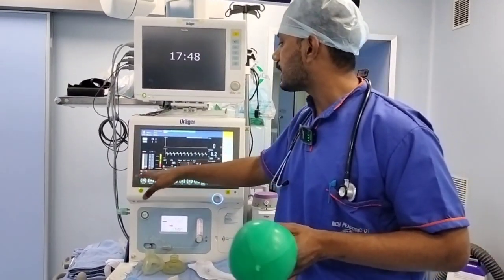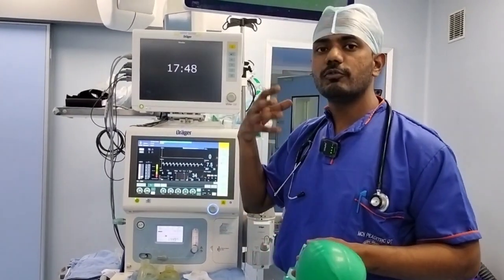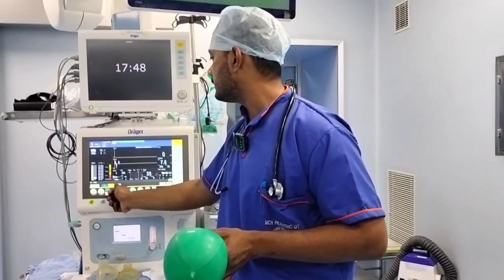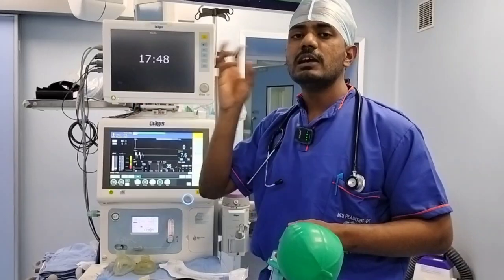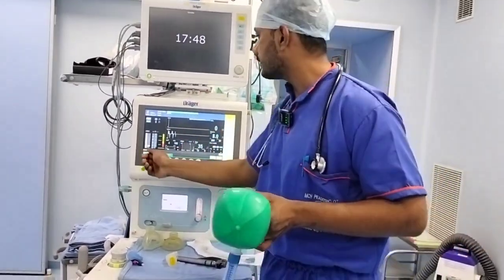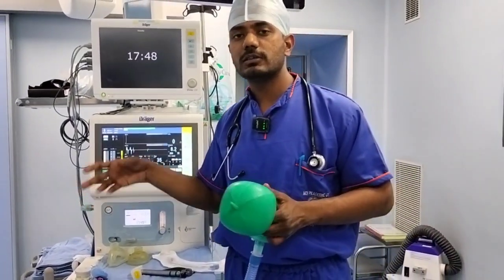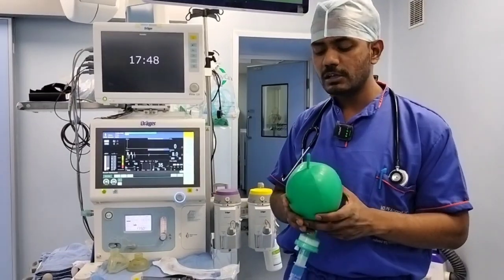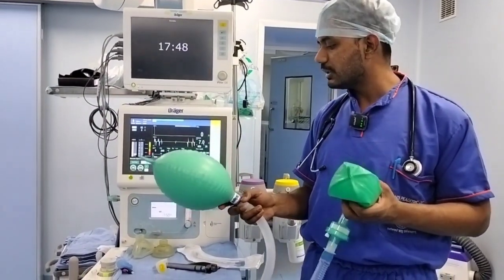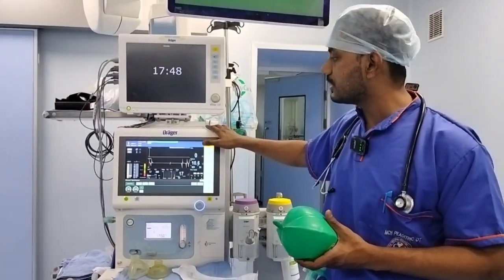Apart from that, there are many other modes. This is what we call volume control mode, where we control the amount of volume going in during each breath. There are other modes called pressure control ventilation and pressure support ventilation. In pressure support ventilation, when the patient breathes, just some support is given to make the breath adequate. Another is manual ventilation, which means the patient is not breathing spontaneously. Only if I ventilate the patient will you see changes in the lungs, else nothing will happen. So why are there so many modes in anesthesia ventilation?